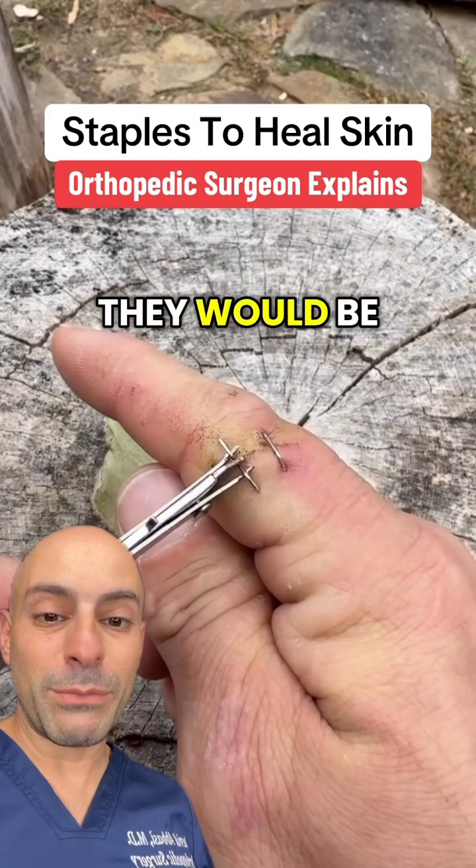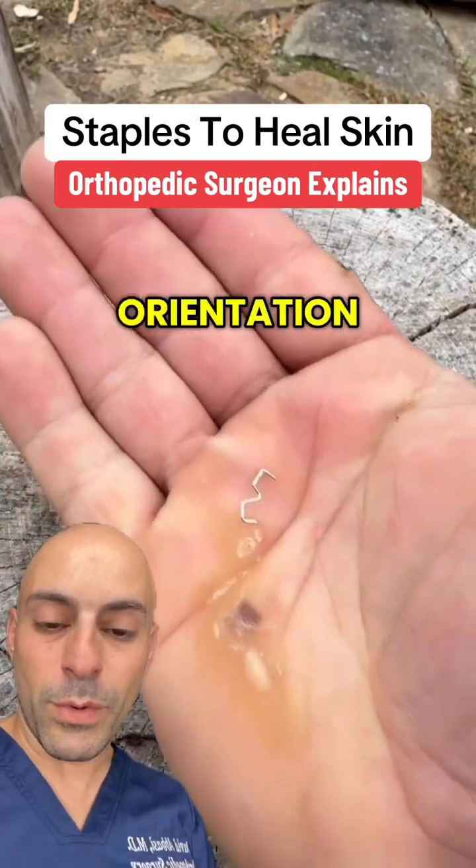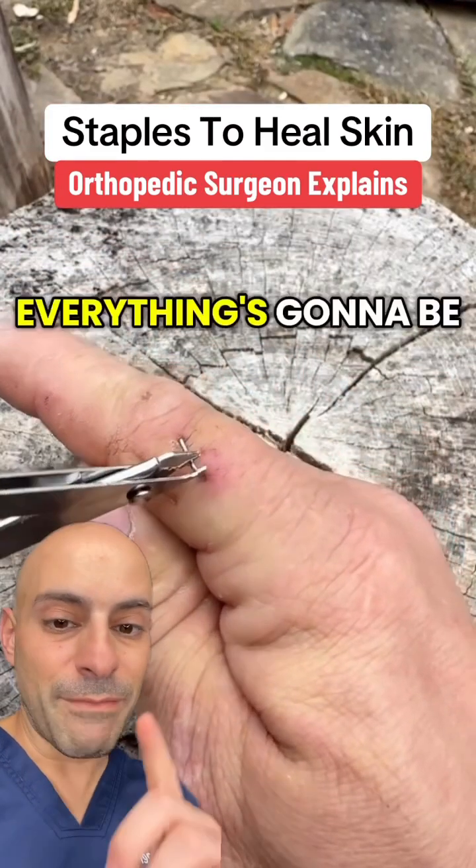To remove the staples, they would be removed just like this. As you can see, it leaves the staple in that type of orientation. As long as those skin edges heal, everything's going to be okay.